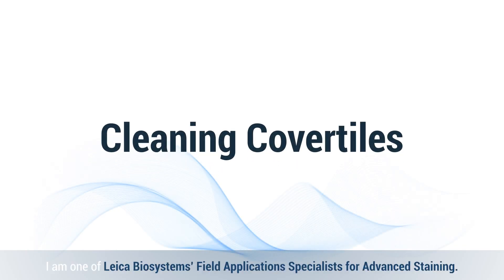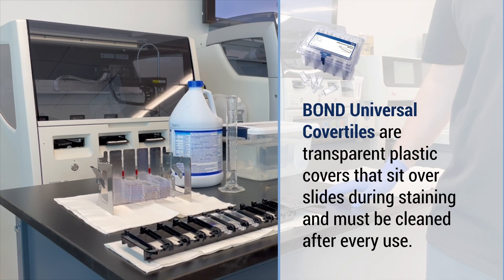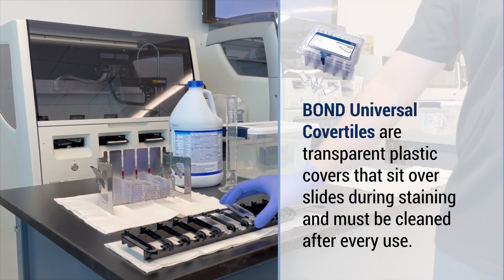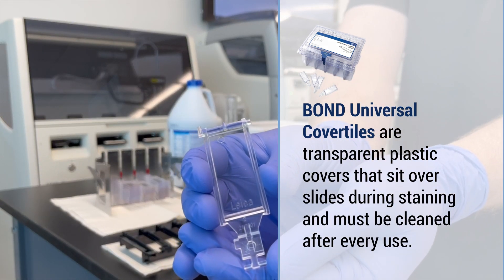Hello, I am one of Leica Biosystems Field Application Specialists for Advanced Staining. I'm here today to show you how to clean cover tiles. Bond Universal cover tiles are transparent plastic covers that sit over slides during staining and must be cleaned after every use.